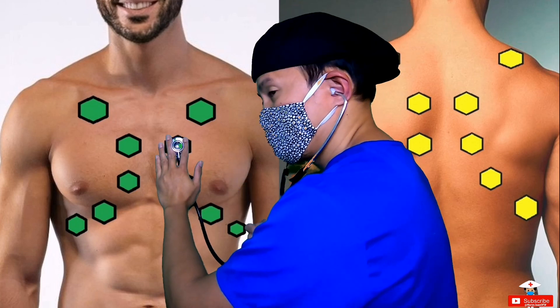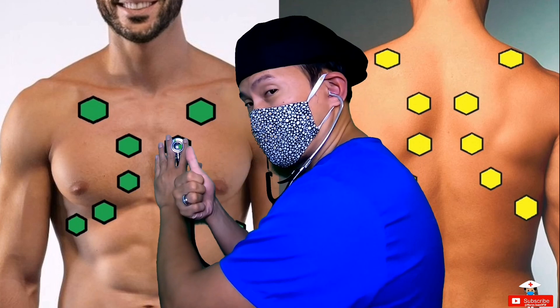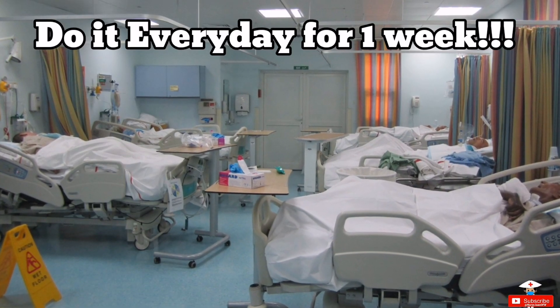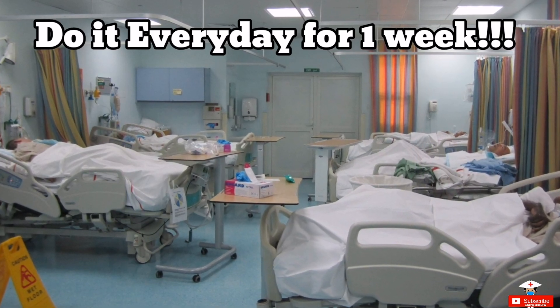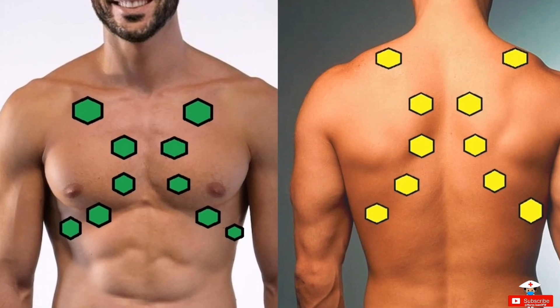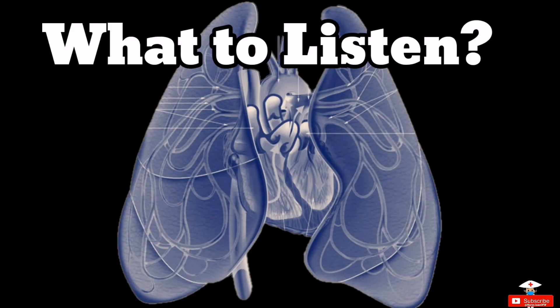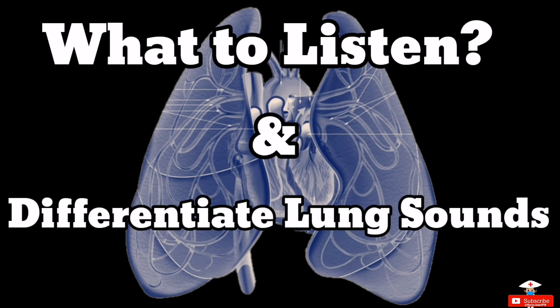Take note: it takes time and continuous practice to train your ears to pick up and differentiate the lung sounds. I dare you — try doing this every day for all of your patients and I'm sure you will get the hang of it within one week or so. Here in the US, you are required to do this as it is part of your shift assessment on every patient. Since you already know where to place the stethoscope properly and where to listen to lung sounds, now let's move to what to listen for and how to differentiate these sounds from one another.